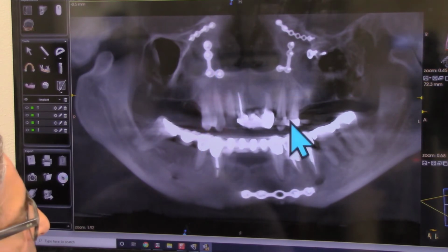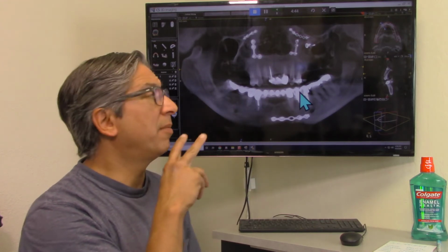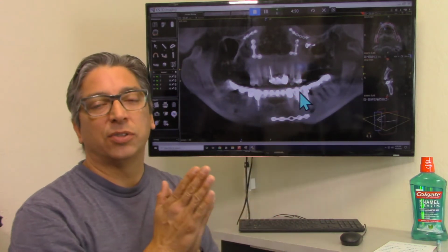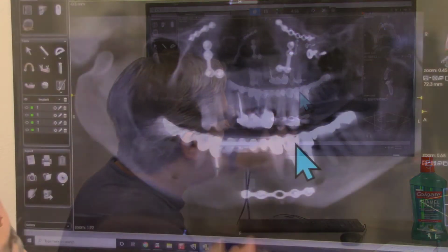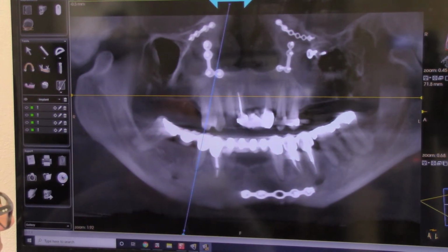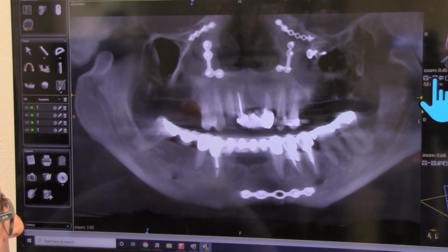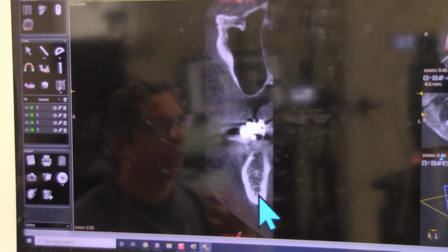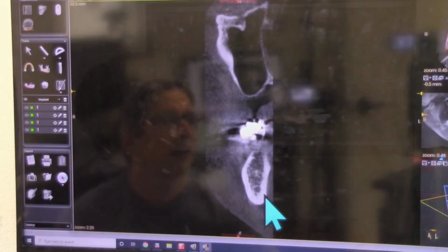I just recently saw her because on our implants, this is her original picture, but she was just in, and we have a cantilever on 2 implants to give her some sort of chewing here, but that loosens up maybe every year, and we have to re-cement it back in. But on the bottom, it's a very difficult case to deal with all of this bridge work here. When that goes, the only thing she's going to really have is to try to get an implant in maybe here. But the bone is fairly soft on the lower jaw, doesn't have a lot of structure to it either. So that's kind of a little bit of a miracle on this case here.